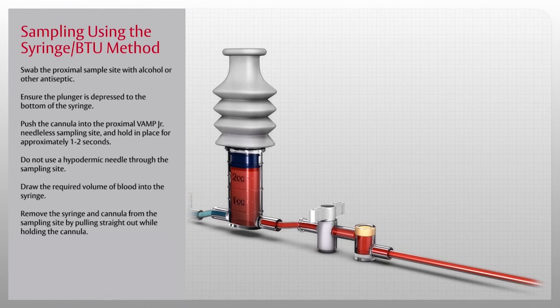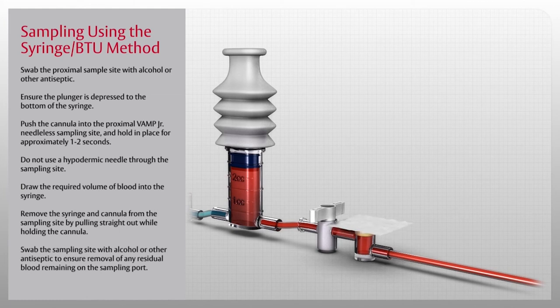Once the last sample has been drawn, swab the sampling site with alcohol or other antiseptic to ensure removal of any residual blood remaining on the sampling port.